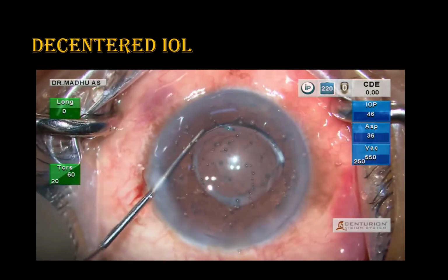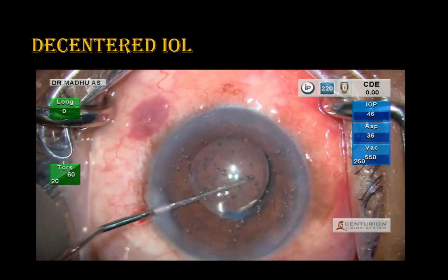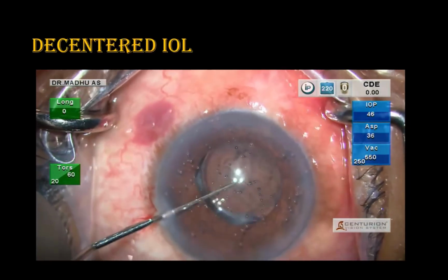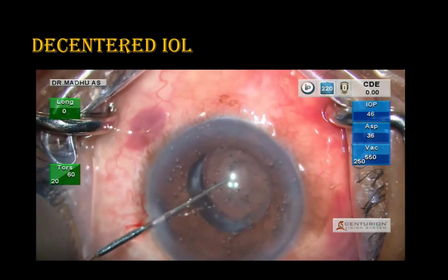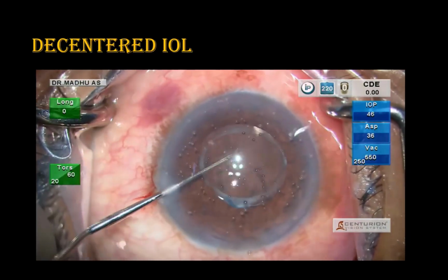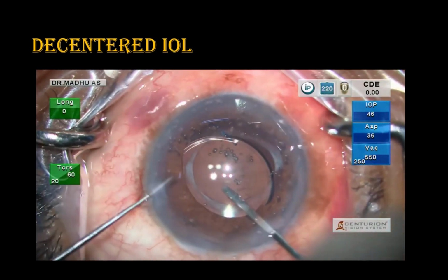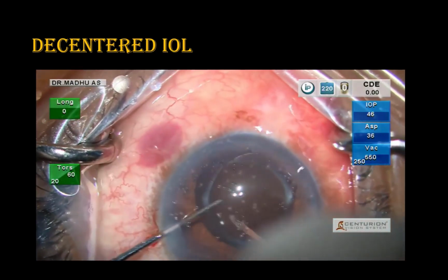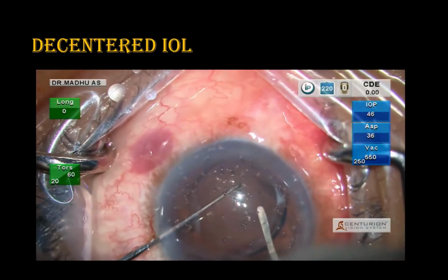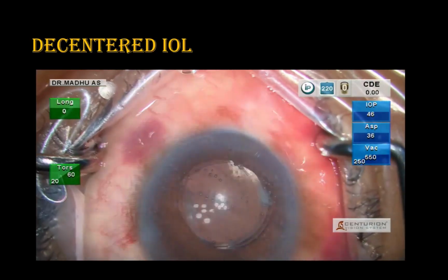I repositioned this IOL with multiple attempts. Again, it was decentering. So I tried capturing the optic beneath the PCR area. So you just don't dial it. You can dial and reverse capture the optic in the capsulorhexis margin. So it will become more stable.